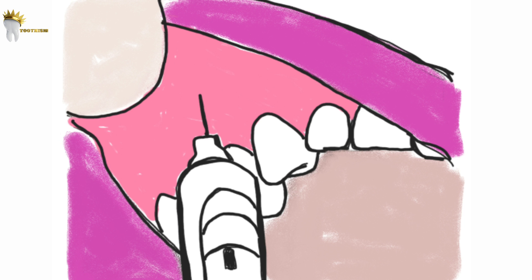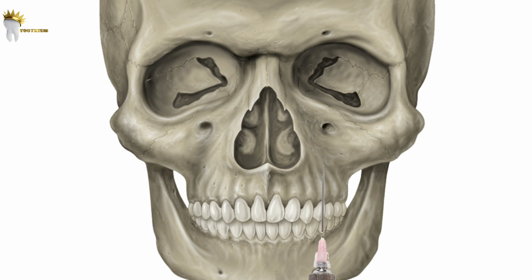Now we retract the lip and pull the tissues to make them taut. We can use our own finger or a mouth mirror for retracting; using the mirror is better as it protects us from needle stick injury. We insert the needle into the height of the mucobuccal fold over the first premolar with the bevel facing bone. The needle should be parallel to the long axis of the tooth, otherwise we might contact bone too soon. The syringe is oriented towards the infraorbital foramen, and the needle is advanced slowly until bone is contacted.